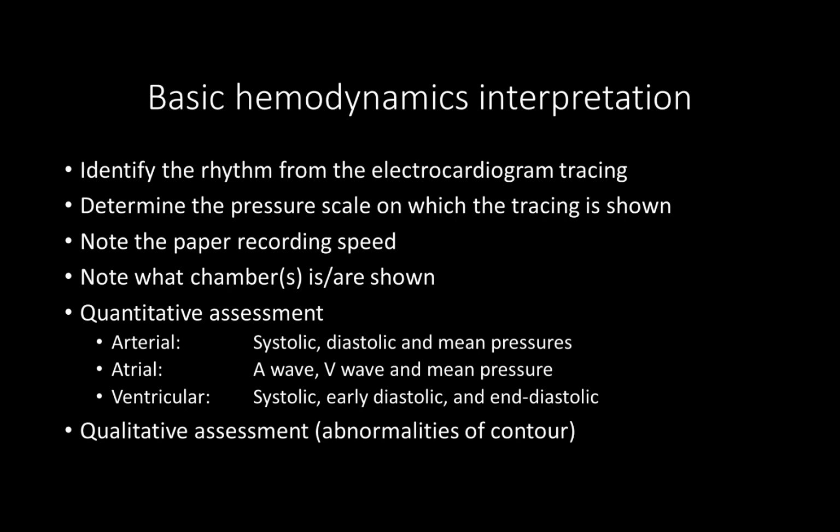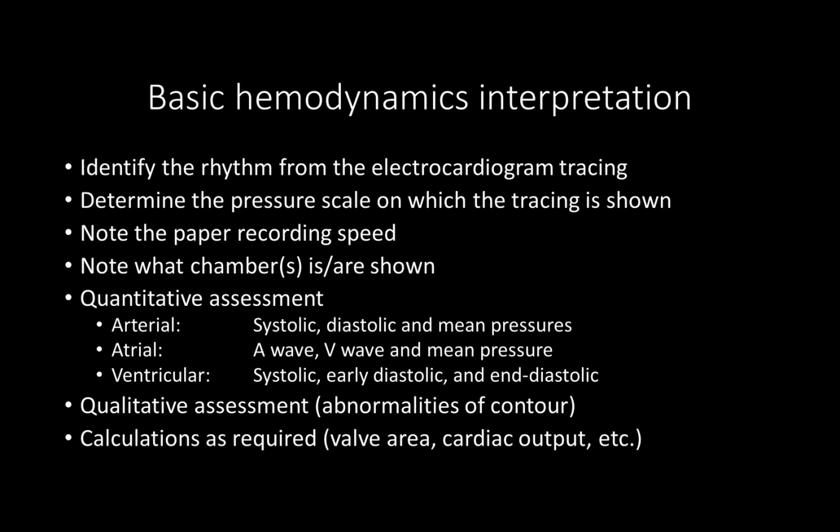Perform a qualitative assessment. This will involve noting the typical curvatures that you would expect to see in these chambers, and also any abnormalities you might see. We will cover abnormalities in future modules. Perform calculations as required. Valve area, cardiac output, etc. We will cover these in further modules.